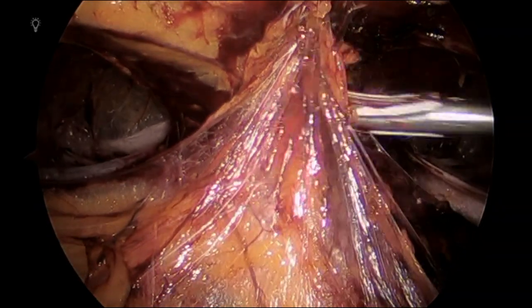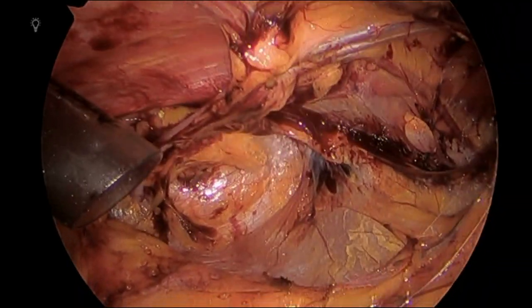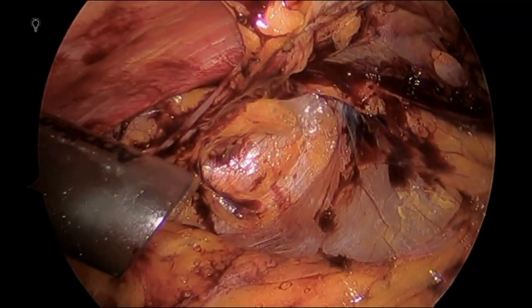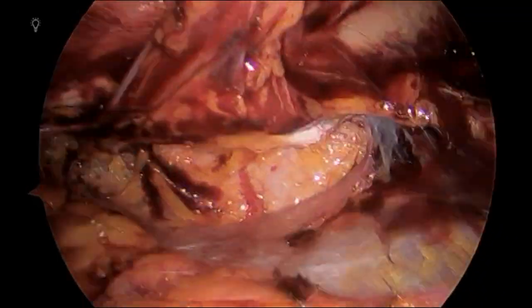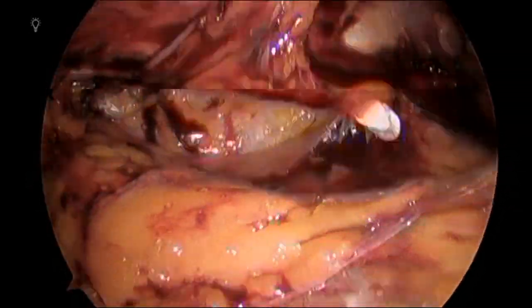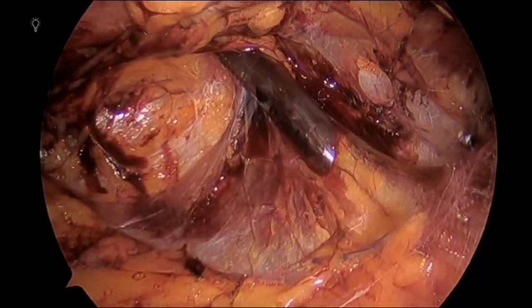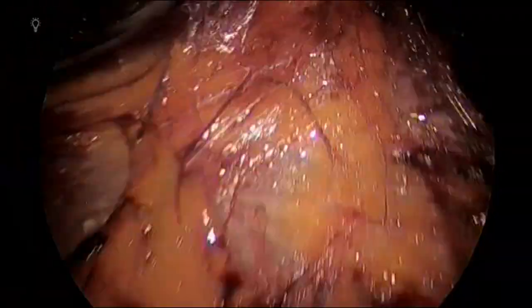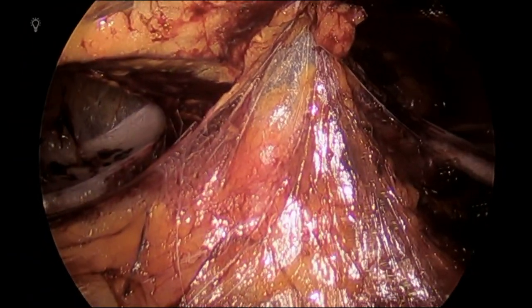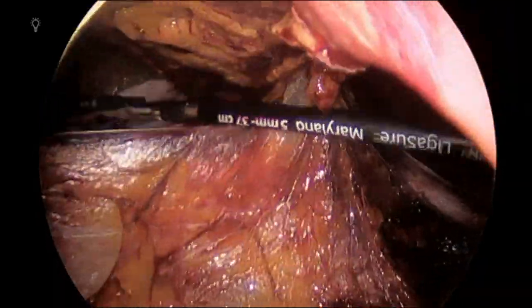Now I am comfortable with the dissection that I have done and I will introduce my last port, taking in mind that if I introduce them lateral to the epigastric vessels, I will diminish the risk of injuring these vessels during my introducing of the instruments of work.